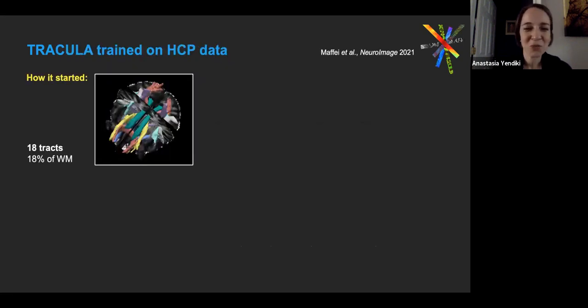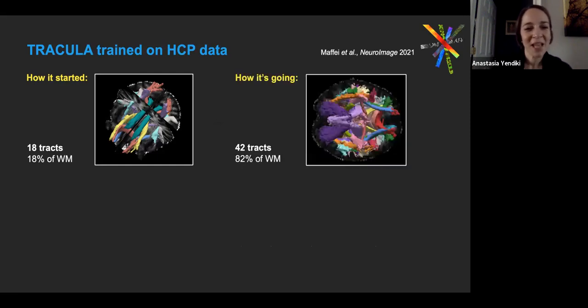In the first version, we started kind of humble. We just had 18 tracts that covered only 18% of white matter. And in the latest version that was released this past July, we have 42 tracts that cover 82% of white matter.